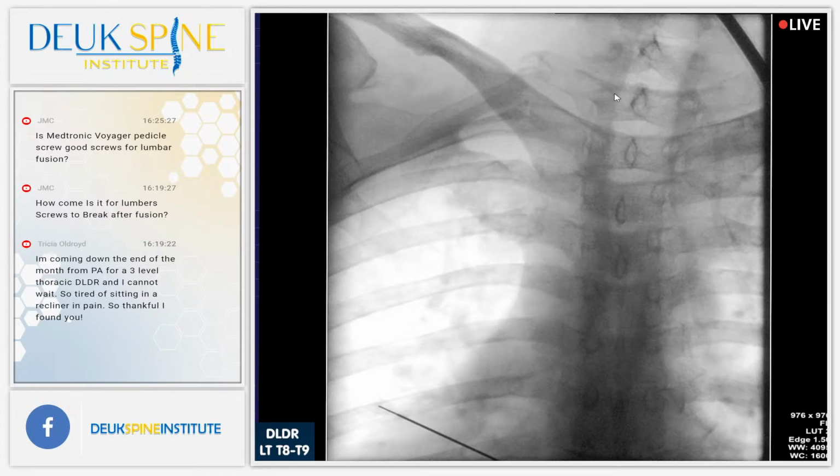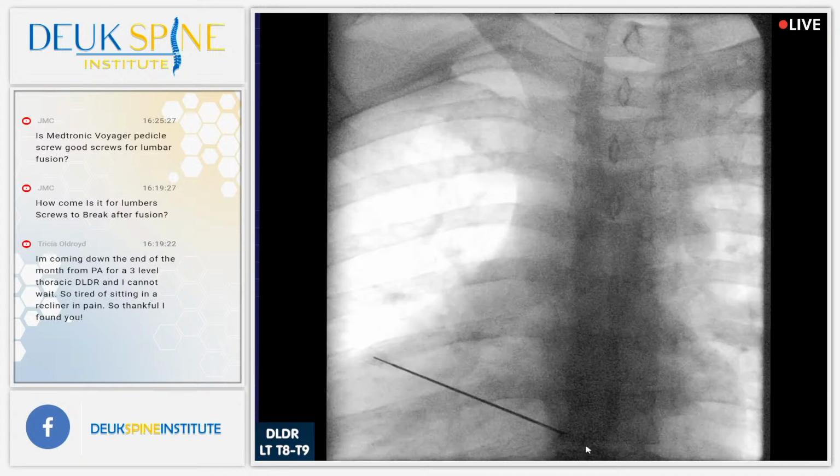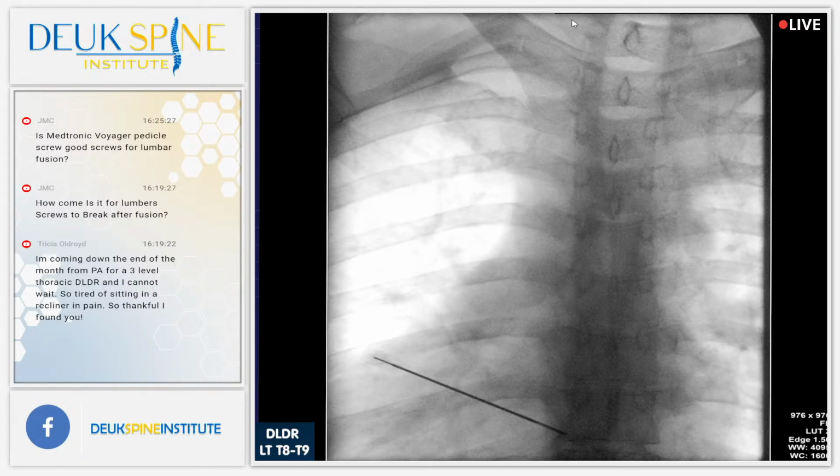Well, yeah, so that looks like 1, 2, 3, 4, 5, 6, 7, and we kind of lose it. Let's come down just a little bit, and again, shot. All right, 1, 2, 3, 4, 5, 6, 7, 8, 9. So counting top down and bottom up, we get the same place. We're at 8-9, so we're perfect. We're exactly where we want to be.